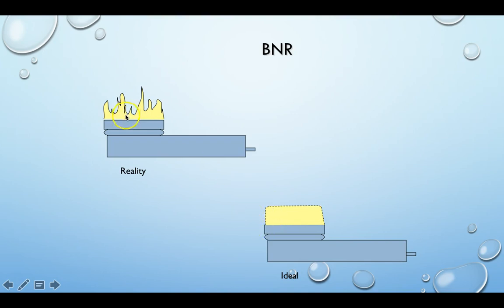What really happens are these peaks and valleys. If we have our average intensity set on the machine as 1.5, that means all of this added together averages to 1.5. But somewhere in there, we have peaks that are significantly higher than 1.5, and valleys that are significantly lower than 1.5.